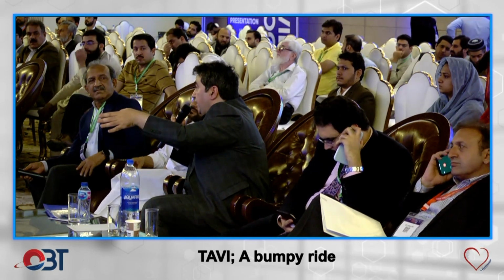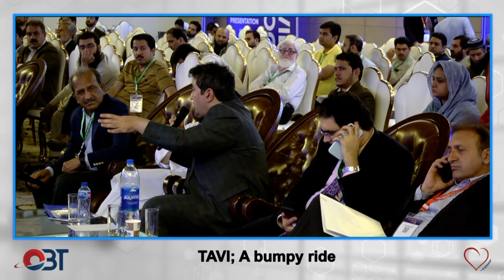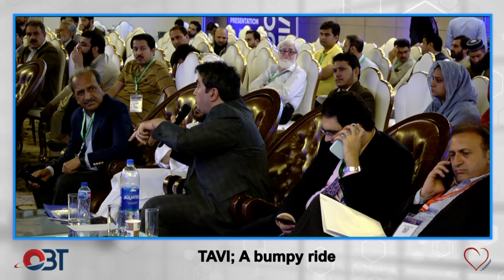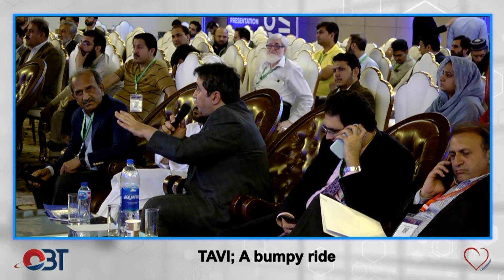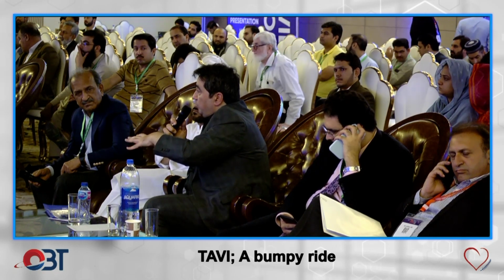And the Lunderquist wire, I might have used a Confida in this one as well, because you had to position, so you had to push on the wire, and the Lunderquist has a tendency to go through the LV because it's a little bit stiffer. But I'm sure the rest of the points were raised.